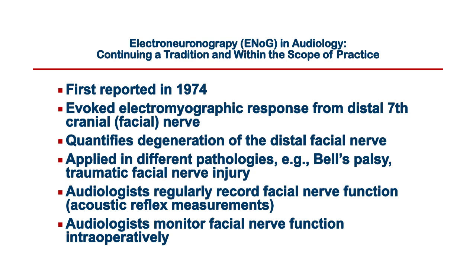So of course I said, yeah, I'm sure we could do that. So I said, let me do some research on it and I'll get back to you. Well, fortunately, when I did the research, which just involved checking out some articles, which I'm going to show you in a moment, I realized that we were in good shape because we had auditory evoked response systems. We had two of them.